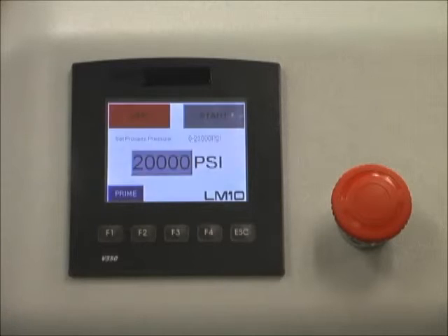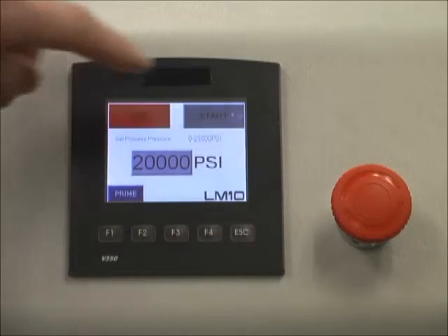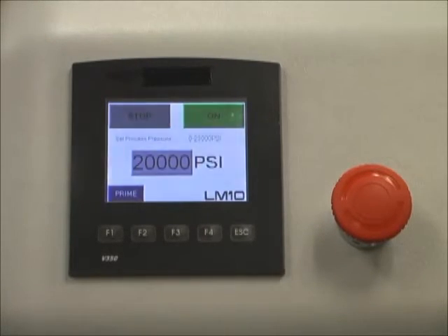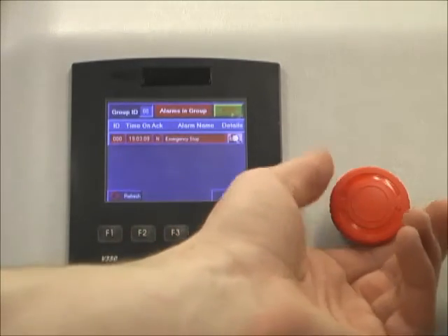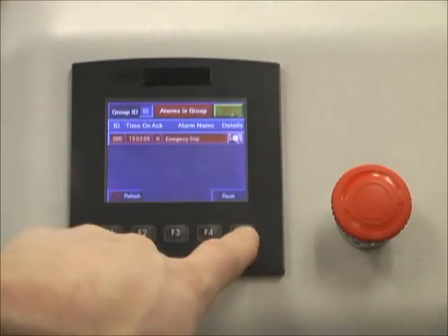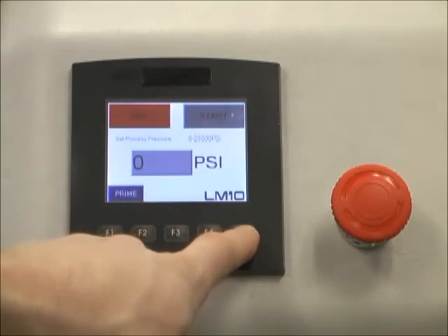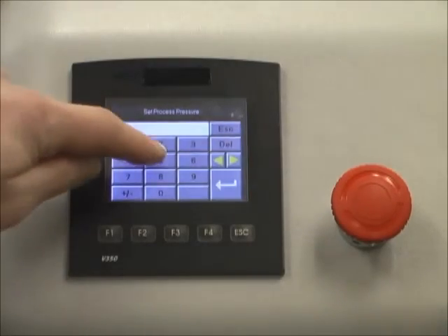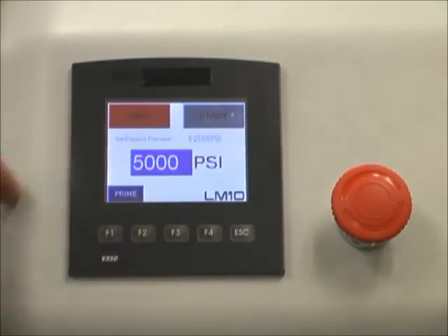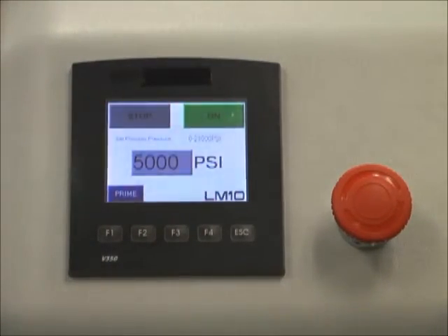The next section demonstrates the E-stop operation. We will turn the machine on and hit the E-stop. You can hear the audible alarm. We will reset, and you can notice the process pressure input resets to zero. We can then start the machine again.